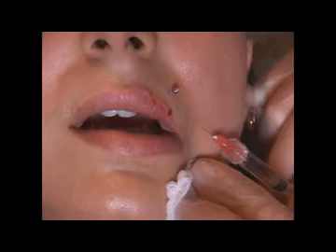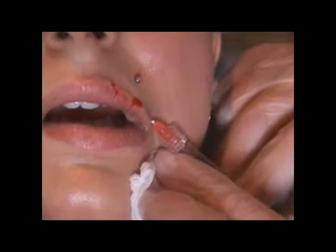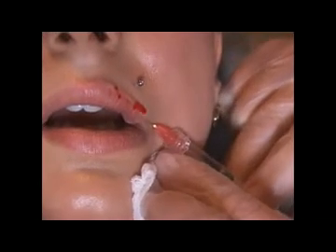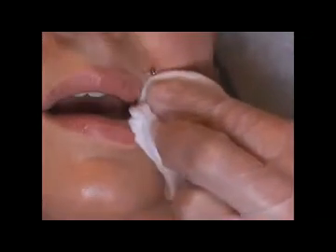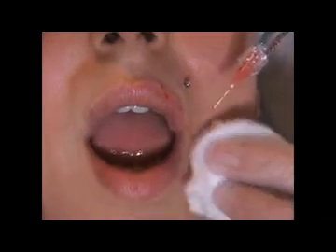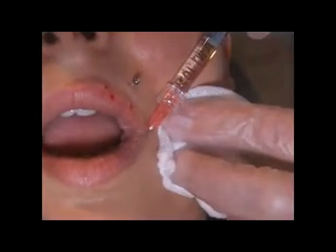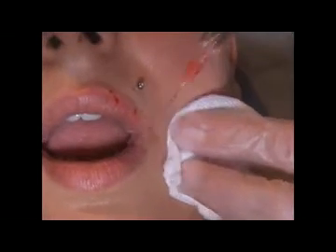Open the mouth a little bit. Always fix the lip — never go in without fixing the lip. We are just at the border; go in, not too much, a little bit of volume, enough. Open maximum, maximum, go here. Same in the lower lip, by retracing.